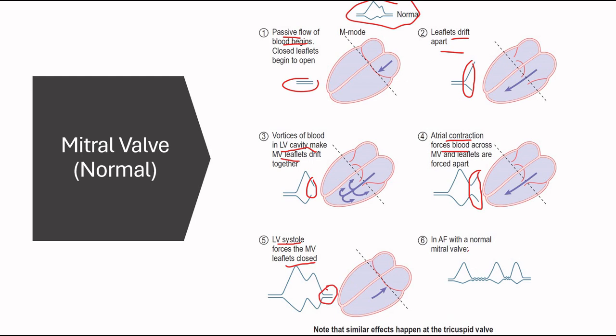And in atrial fibrillation, this is what normal M-mode through the mitral valve looks like. As you can see, there is no atrial contraction, so we lose the second peak here. As in AFib, there is no atrial contraction.